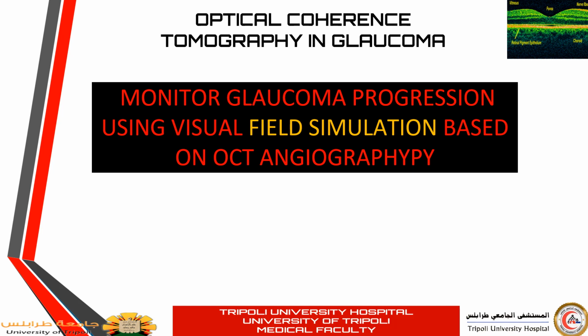automated perimetry that is available currently is, number one, not reproducible, and you need at least 3 serial visual fields to confidently confirm and establish the diagnosis of glaucoma. And also for the confirmation of progression of glaucoma, you need at least 2 to 3 serial visual field studies. And you will see in the next slide that to achieve this, a marked reduction in the retinal sensitivity will be there before you confirm the progression of glaucoma.